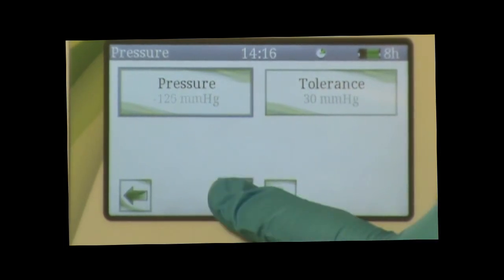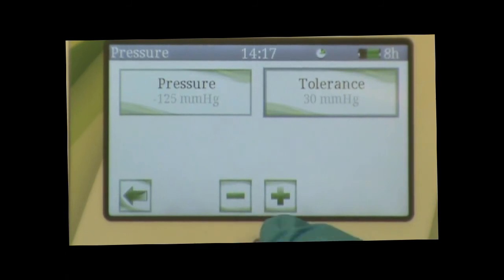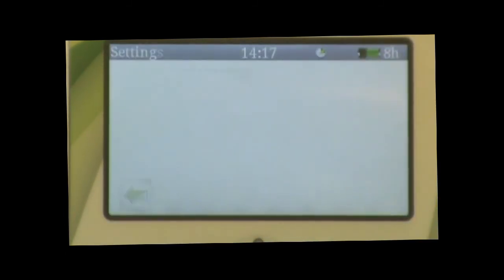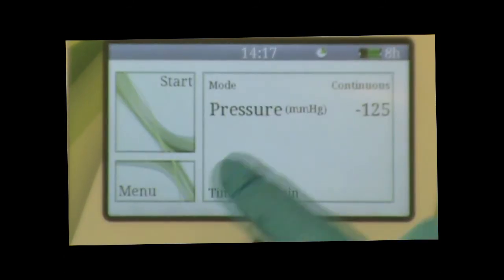Pressure setting to adjust the pressure settings. Press the tolerance to adjust the tolerance. Press the back button until you reach the main menu and press start to start therapy.